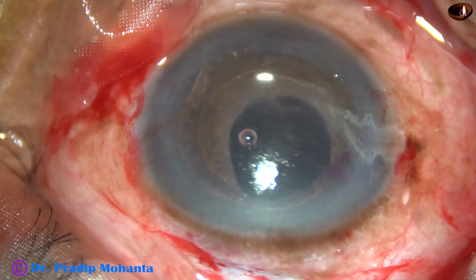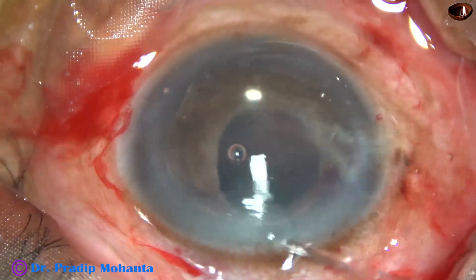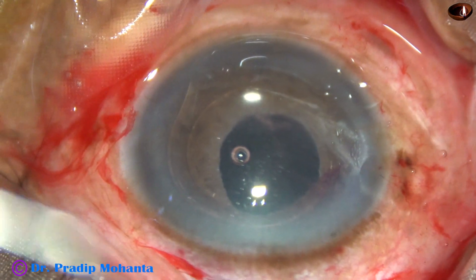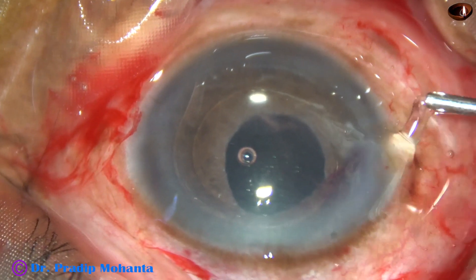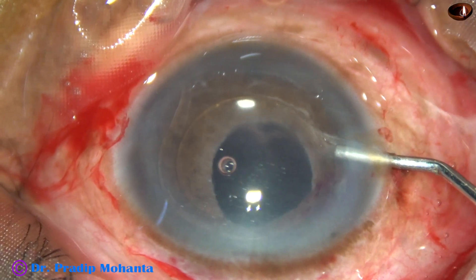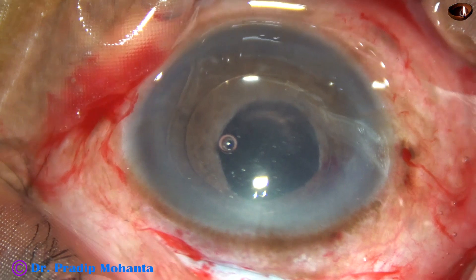I find that the anterior chamber has become shallow, so I inject some more viscoelastic — some more HPMC. And now it will be safer to remove this intraocular lens.